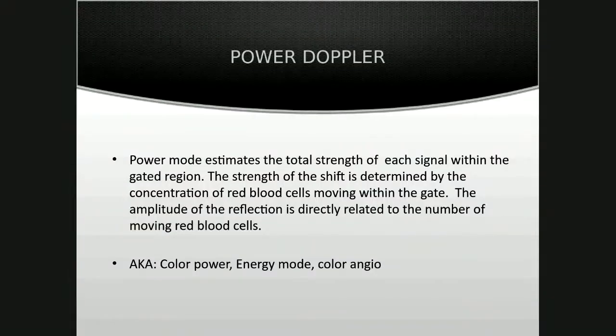Power Doppler is not really a real Doppler, but it's what we use when we're trying to pick up really slow flow. So you need to know that this button can also be referred to as color power, energy mode, or color angio. Again, you'd have to look at your machine and see what the manufacturer decided to call it, but they're all the same exact thing.